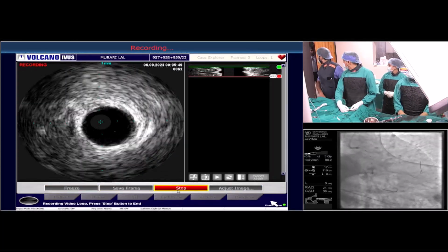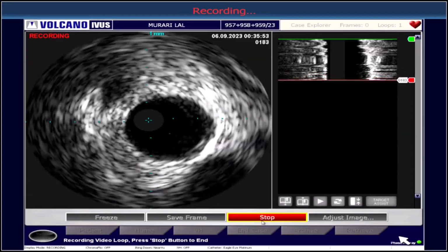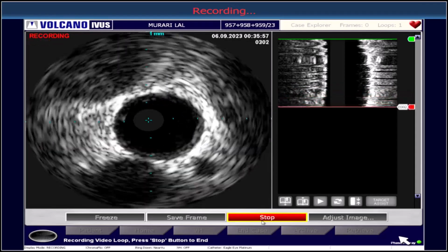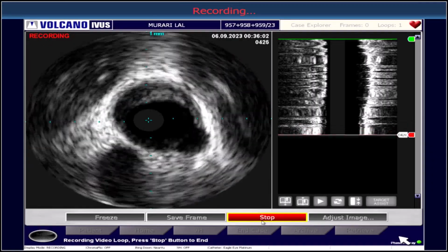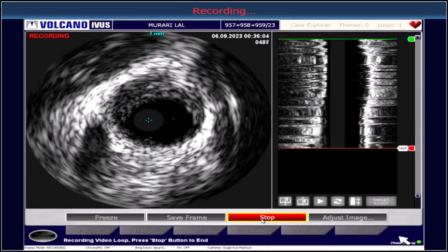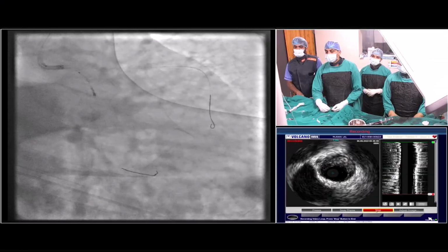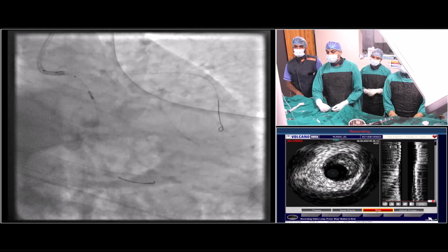So we're starting. The distal vessel is 3 mm. Here it looks around 3.5. So coming back, no plaque yet. No, the plaque has started. Looks more lipidic plaque, and once we, yes, fibrolipidic plaque, there is no calcium, and you can see the plaque burden is significant.